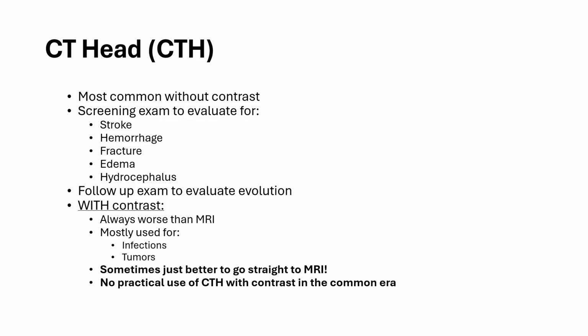If you get a CT head with contrast, you might as well just get an MRI. It's most useful for looking at infections and tumors, but sometimes it's just better to go straight to an MRI rather than a CT head with contrast. There's no real practical use of a CT head with contrast in the current era.